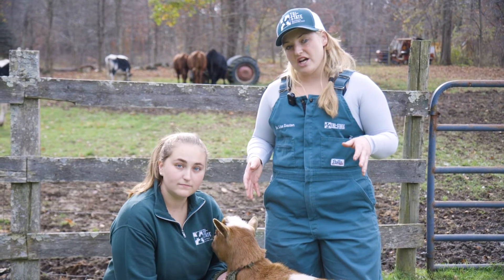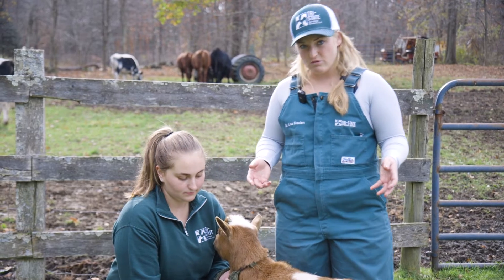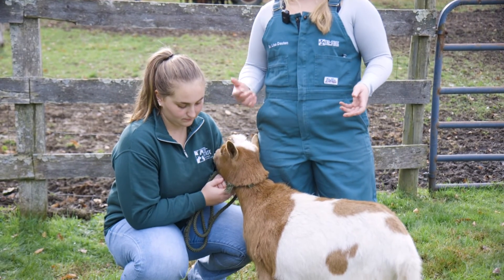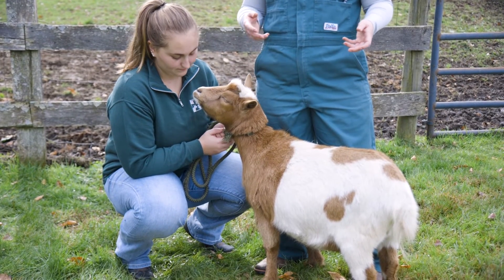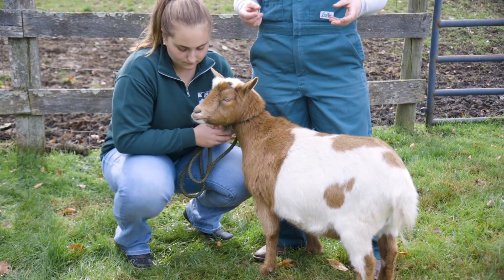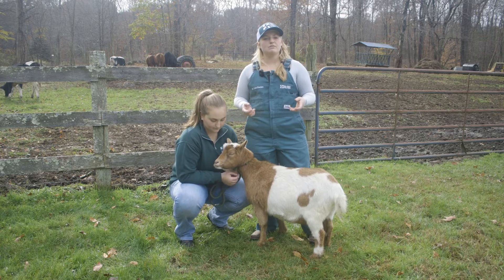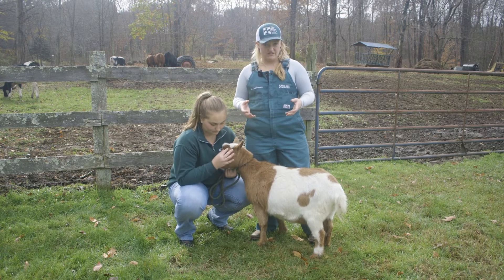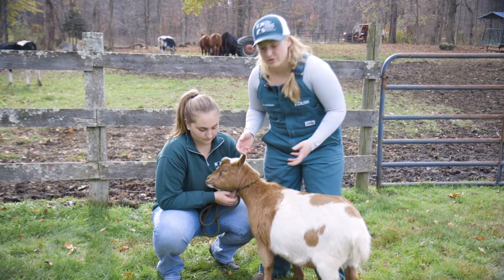When giving IM injections, the best places to give medications are in two locations. The first is an option of giving it in the neck region. In small ruminants this is a little bit more difficult simply because there's less of a window to give it in. In cattle and horses this is an easier area, so you'll see IM injections given there more. However, I'll show you where to put it today.